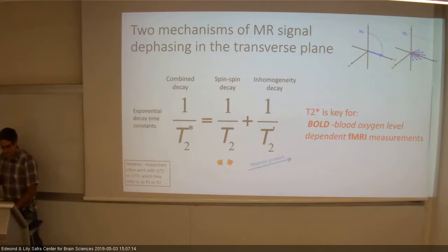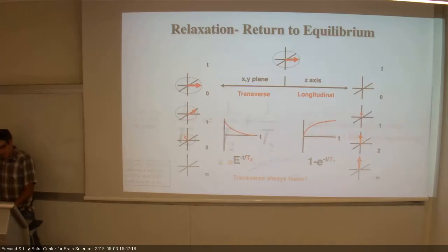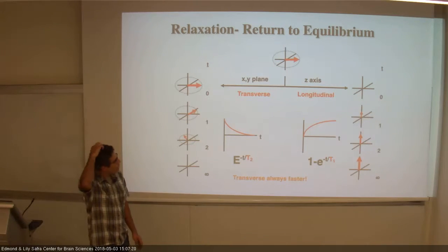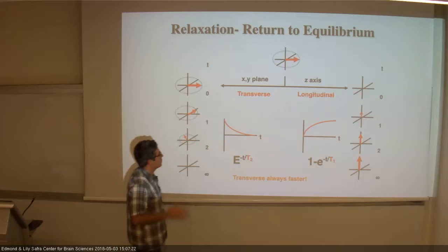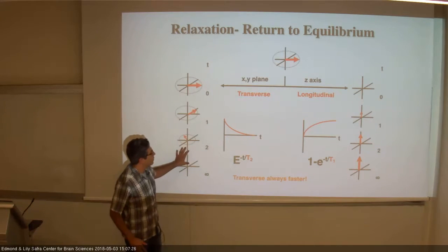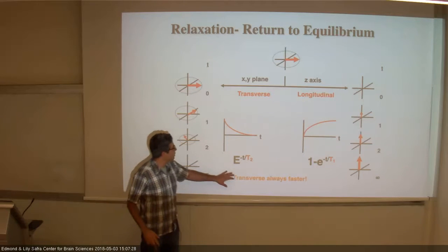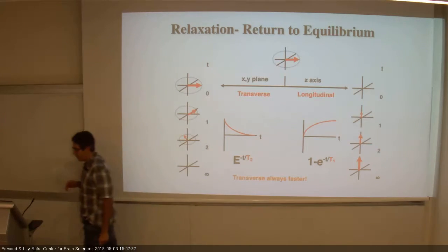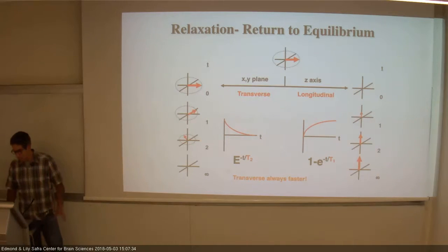Anyway, so now you're getting into the idea of the phenomena. Now we need to find ways to measure them. Just a summary: there is a T1 relaxation and a T2 relaxation. We describe them as two phenomena, and we also say that this transverse T2 phenomenon is faster. This is just a summary. Let's do one more summary thing.